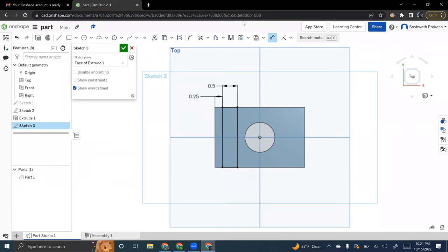So now you're gonna click the left edge, where it's the left edge of the rectangle. Good. And then, so you wanna escape real quick. You're gonna make two clicks. Make sure you click the dimension tool again. One click on the left side there, and then one click on the far left there. And then that's gonna make the width. So you can move your number over to the left so you can see it. Good, and then make that 0.25. You can click anywhere from here. And that's 0.25.